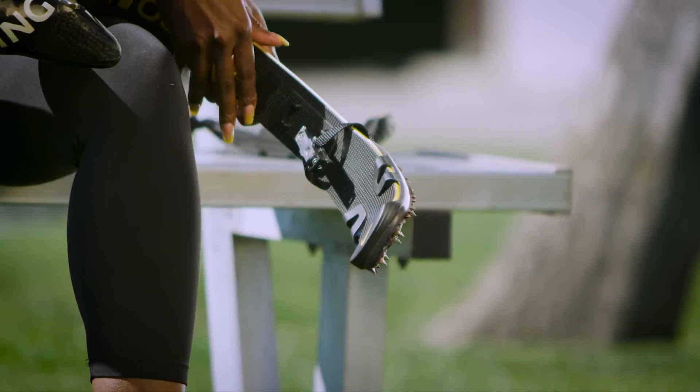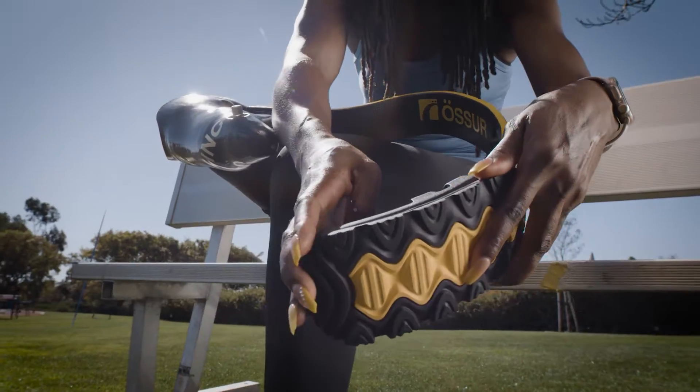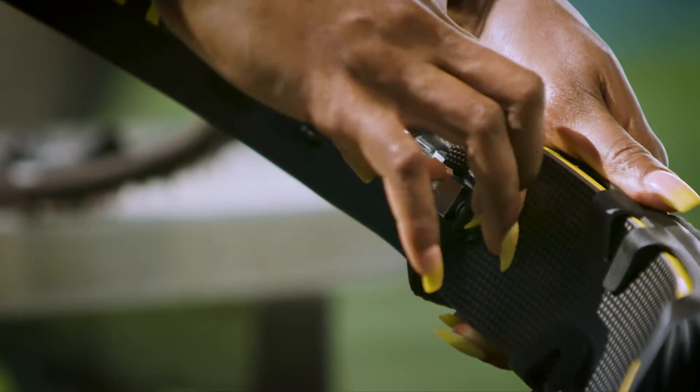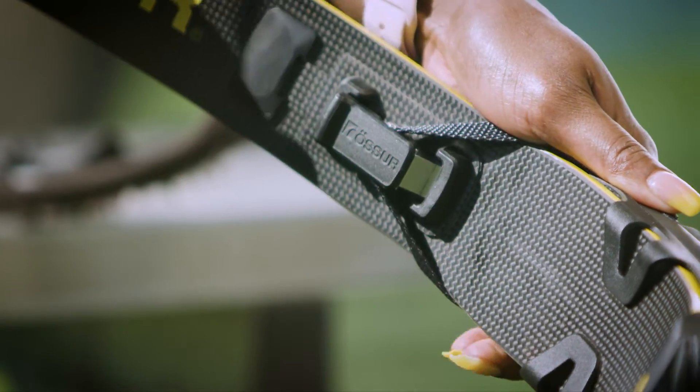With a simple click, I can easily swap out the Nike Spike Soul X with the Nike Traction Soul X on my XL blade and walk off the track without any worry of slipping or damaging the spikes. It's a game changer!